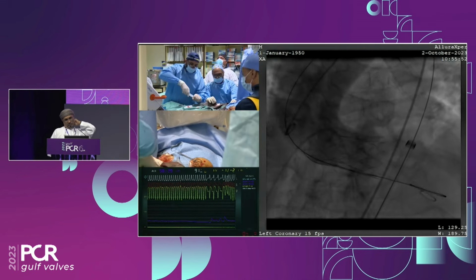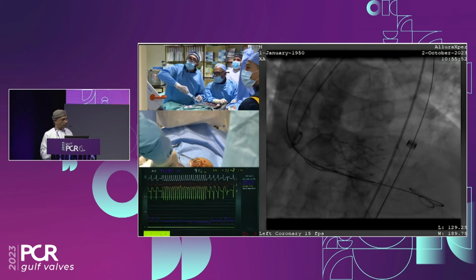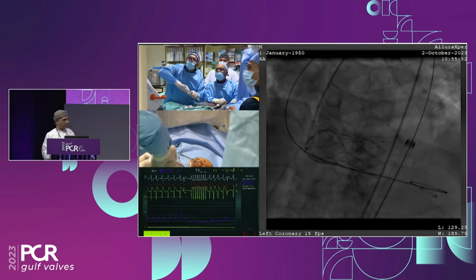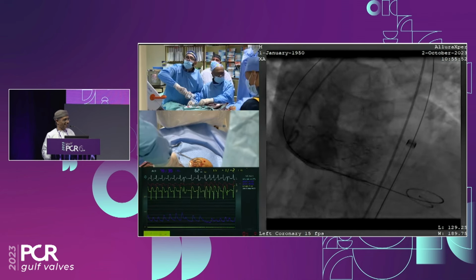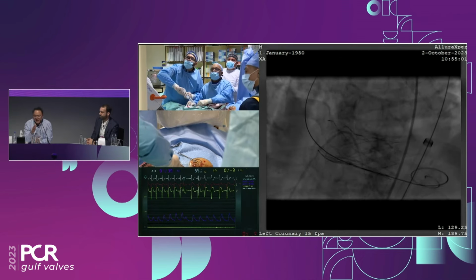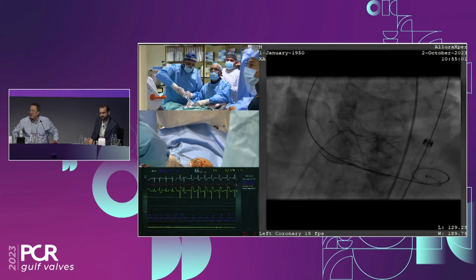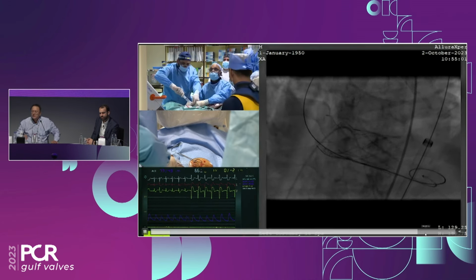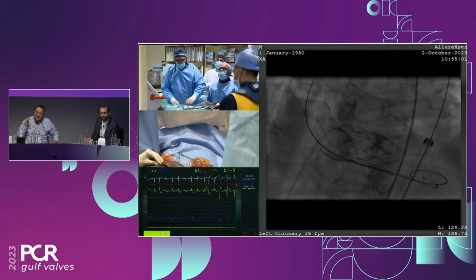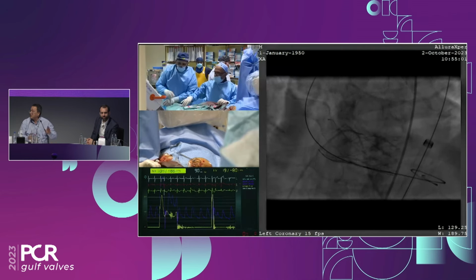Beautiful. So this balloon is Atlas. Atlas Gold. The only time I'm going to use it in a regular case is when I have a calcified valve and I'm really expecting a recoil with the regular balloon. So I want to make sure that the balloon is super stiff and does the job. This is one of the few indications I use Atlas Gold, apart from fracturing a valve.